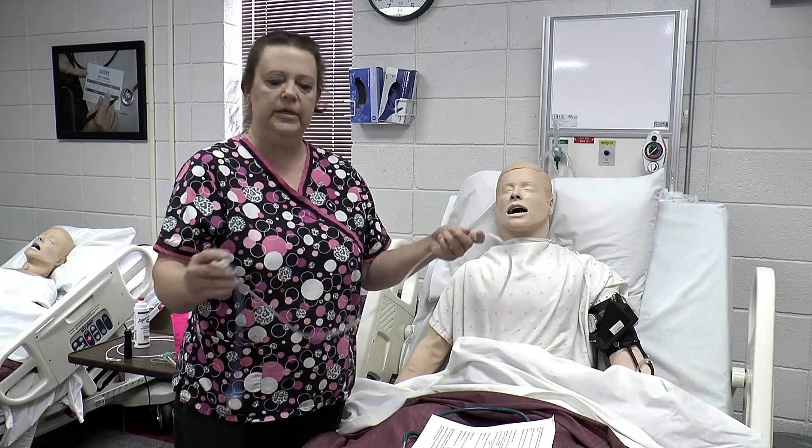Before we get ready to insert, of course we get our supplies and we need to check the order — make sure you have an order. When you go into the patient's room, you make sure you have your patient identifiers, your three identifiers: asking their name, date of birth, checking their armband, making sure you have the right patient, the right birth date, and the right ID number. Check the order, find out the symptoms — does he really need one? Is he getting nauseated? Is his stomach getting distended?